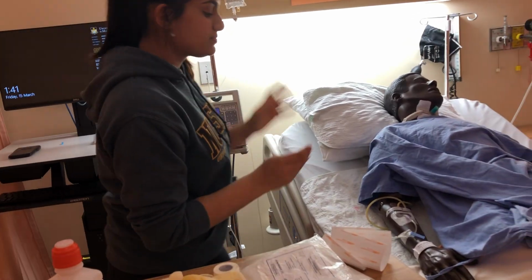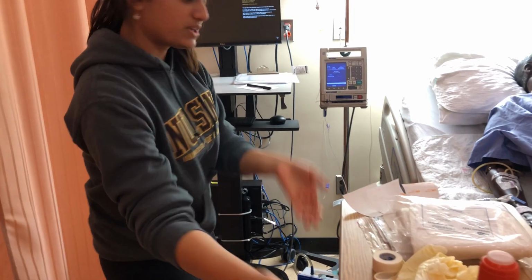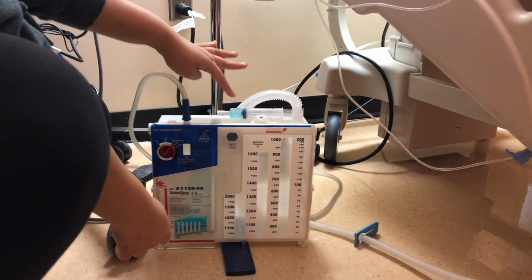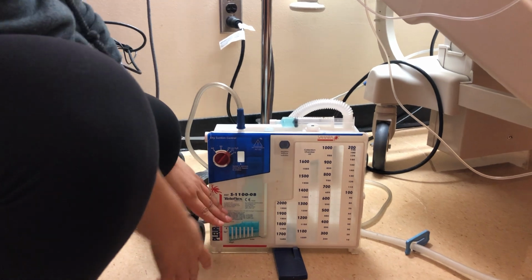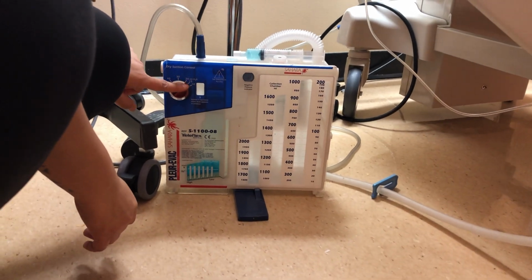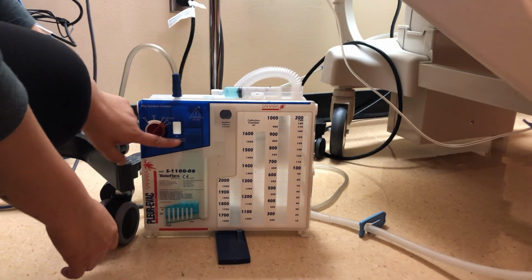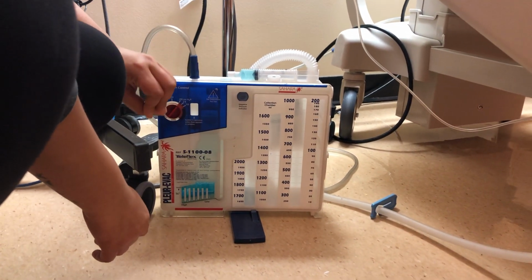So I'm going to do my safety checks here for right now for the demo. Right, so we can go down here. So I'm following the tubing again. It's connected to this collection chamber here. So it has continuous bubbling, which should not be happening. It should be gentle tidaling. So we're gonna figure out why there's an air leak in the air leak meter. It's 20 centimeters of H2O, so that's good. The orange ball should normally be present, but this system isn't intact right now.